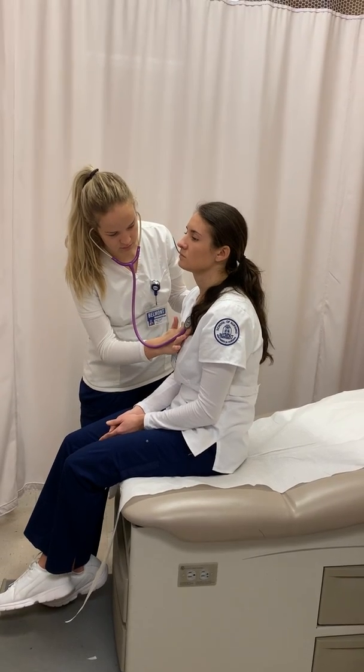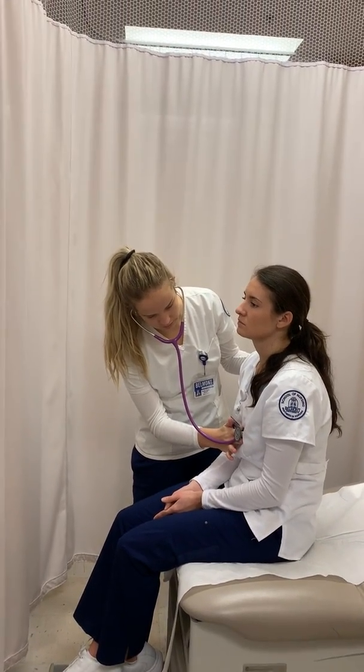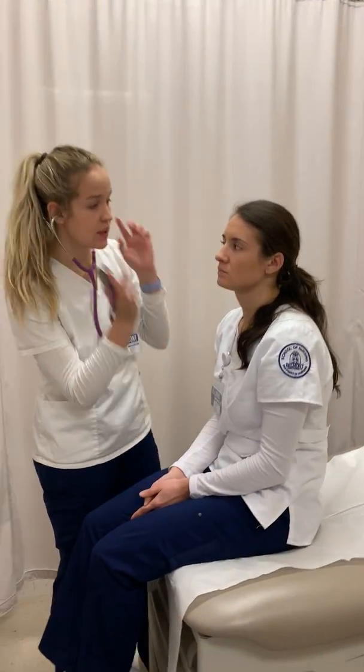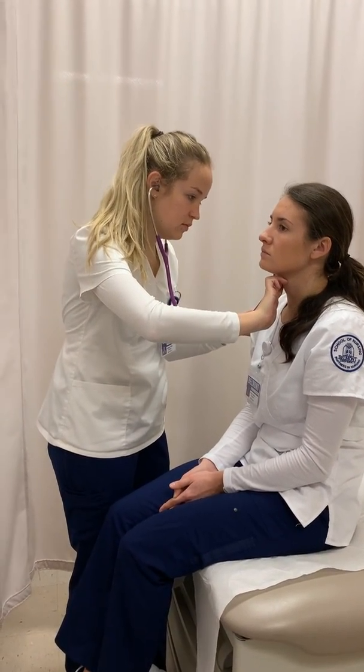I'm going to do a quick assessment of your head and neck to make sure blood is flowing well. I'm also going to listen to your carotids. I listened using both the diaphragm and the bell of my stethoscope. Upon assessment, S2 is louder than S1 at the aortic and pulmonary valves. S1 and S2 are equal at Erb's point, and S1 is louder than S2 at the mitral and tricuspid valves. No bruits were noted in any of these spots, as well as on the carotid arteries. That would conclude this assessment.